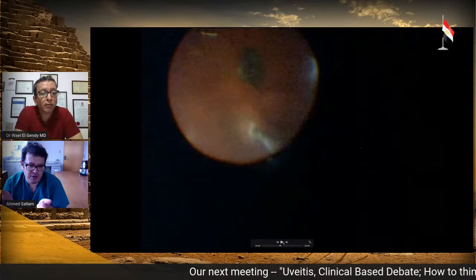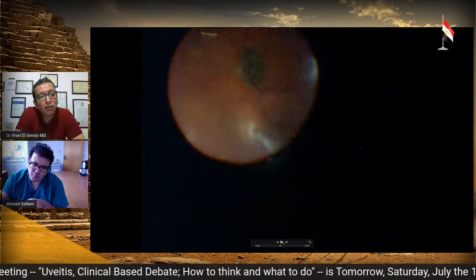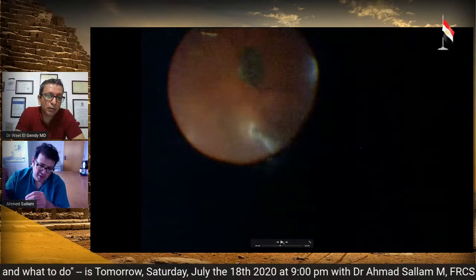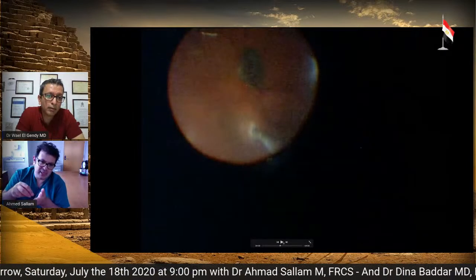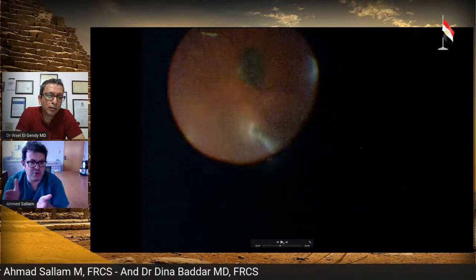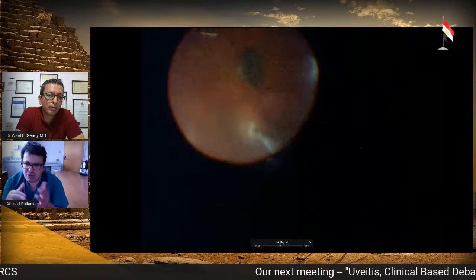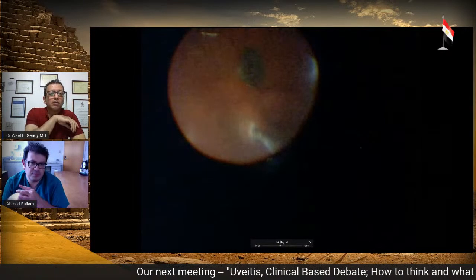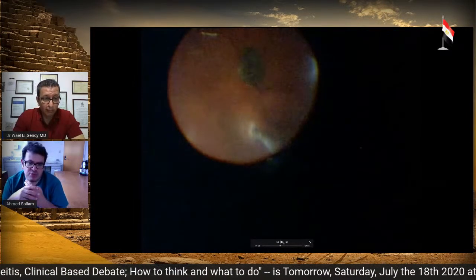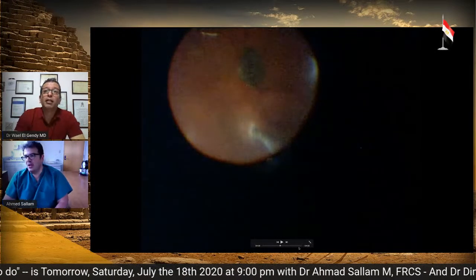And I think this is fair enough because with an oil it is best to suture all ports. So I would open the conjunctiva, get this 20 and put a backflush. And if you don't have a backflush, you can use one of these large draw-up needles. And then it's working passively. Because of the mismatch that you've created between the infusion and the aspiration, your actual risk of high pressure is very low. And I feel this is a nice tip for people who are just trying the direct exchange for the first time. Yes, this is a very good tip. Very good tip.